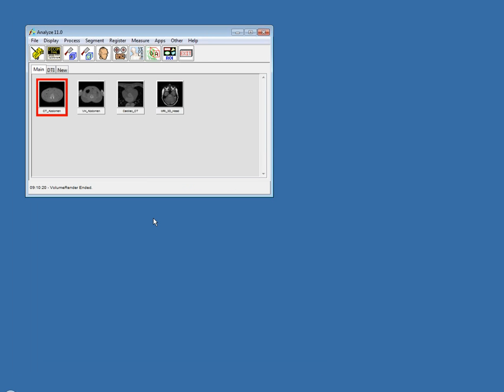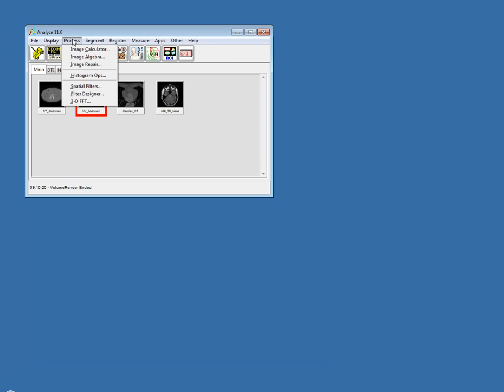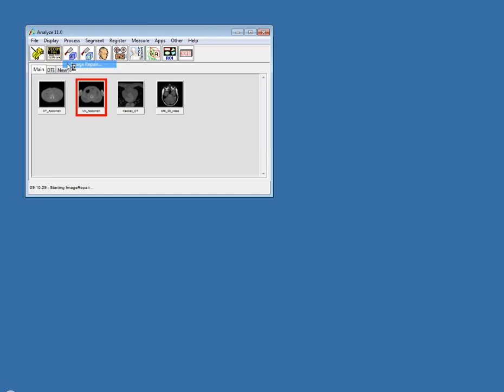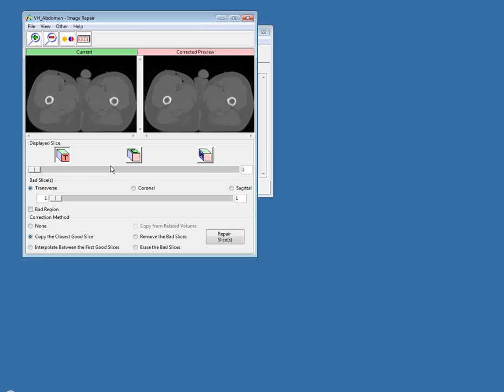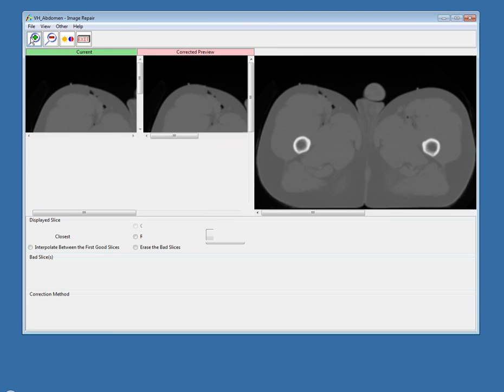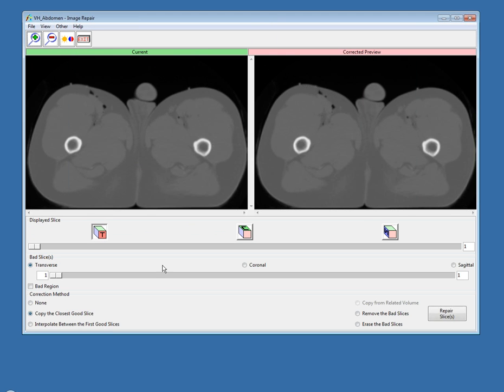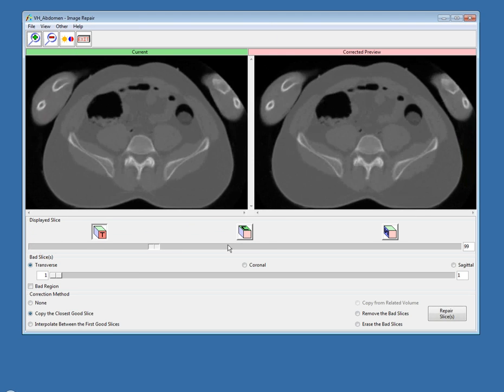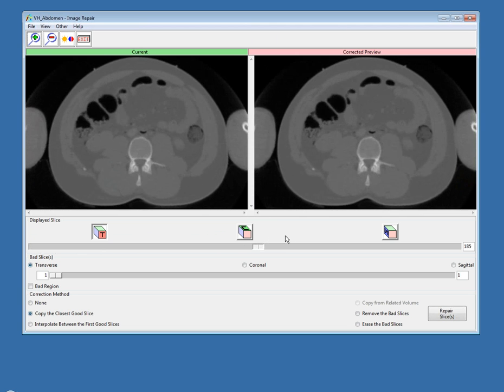Next, I'm going to show you the New Image Repair Module, available underneath the Process menu. What it allows you to do is correct corrupt regions or corrupt slices within a dataset. Within this dataset we have a few corrupt slices.